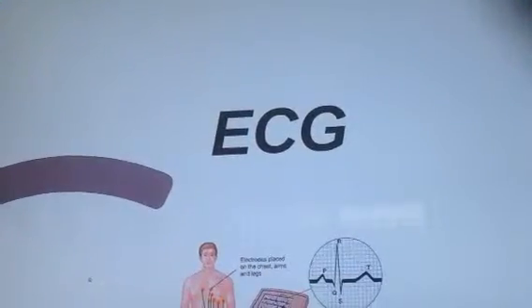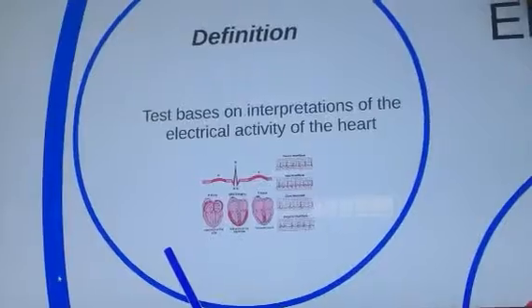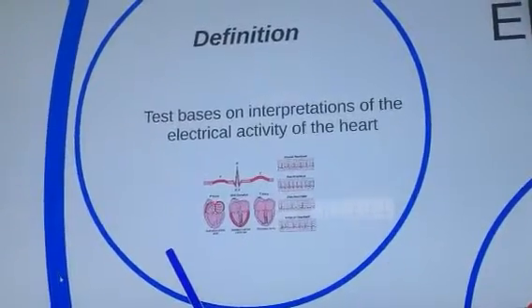Welcome, I'm going to talk about electrocardiography. First of all, I want to talk about the definition. Definition: electrocardiography is a test based on the interpretation of the electrical activity of the heart.